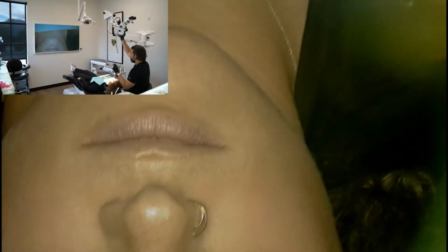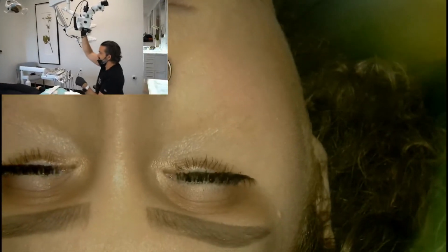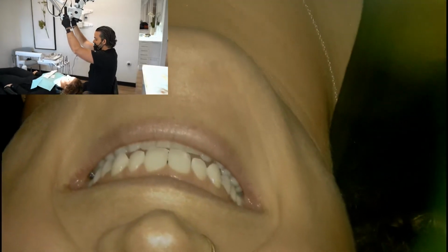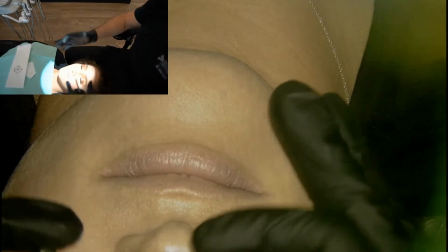I mean, you can see that I've got the light in the patient's pretty eyes here. Say hi, smile, show them your eyes. Yeah, now you're blind, seeing dots. But if you go up high, Michael, if you want to come in on the ring around her face, her eyes are closed because the light's in her eyes. And to overcome that, and it helps for patient privacy, you would actually put dark goggles over her eyes. And that would kind of help the fact that what you see cropped in and the ring of light here are a little bit different. As you come down, you can control that light and keep it out of the eyes.